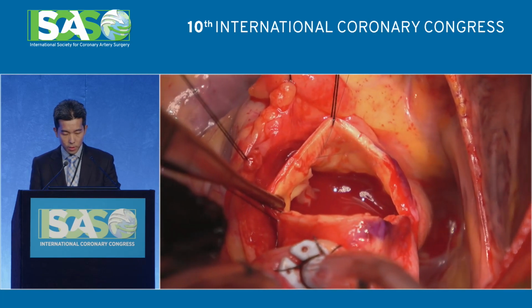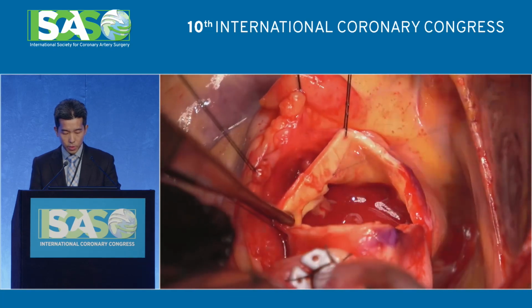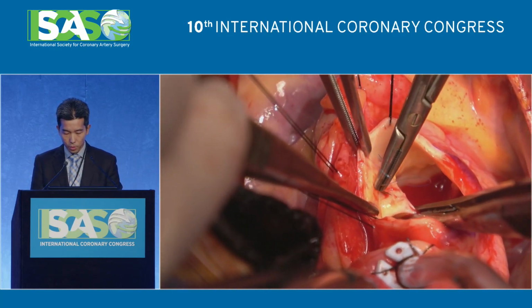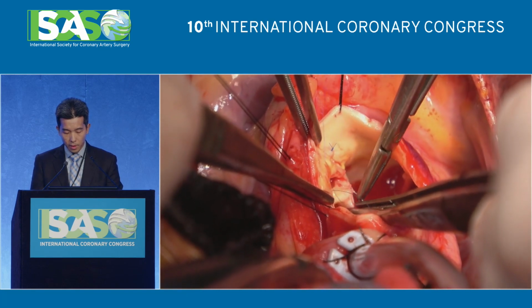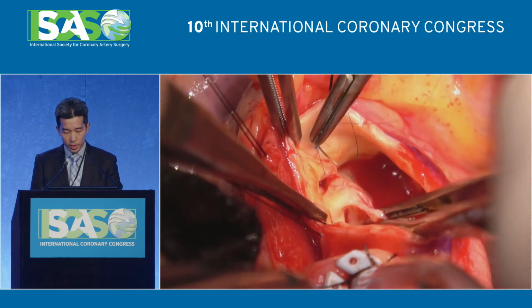So this is one way to do it, although sometimes a simple suture can perform enough of a marsupialization, so you don't have a little bit of the distortion that you can see when you do it like this. But in this case, we thought that it was helpful to really pull back the edge of the unroofed segment.